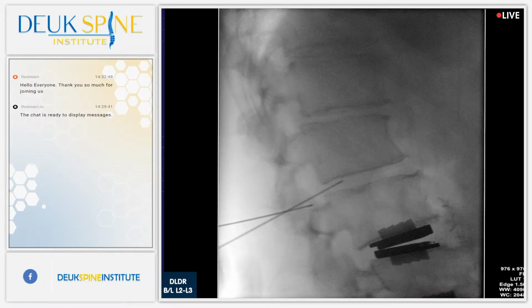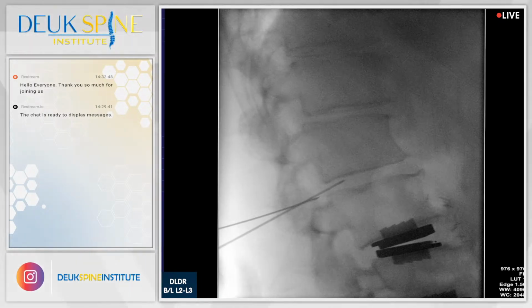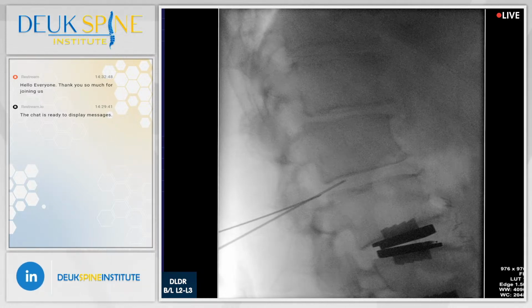Now we use a top-of-the-line fluoroscope. This is Siemens, which is a German company, and they make the very best fluoroscopes in the world, which is why we use them.